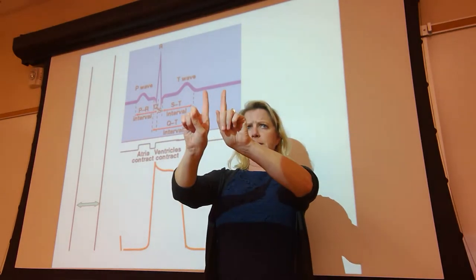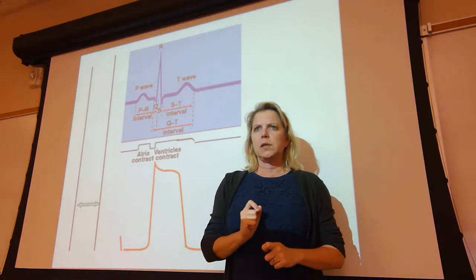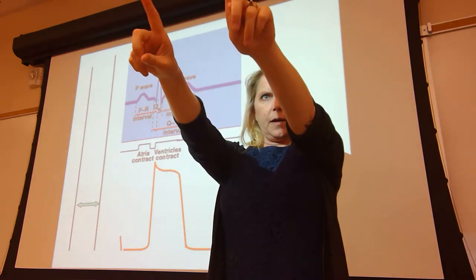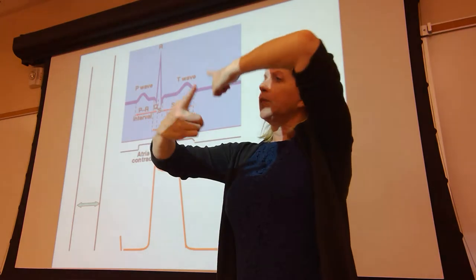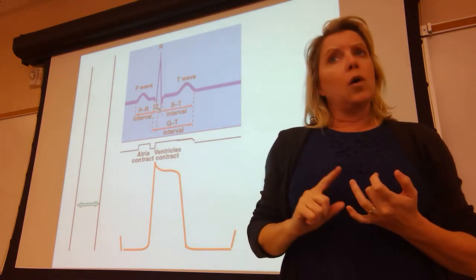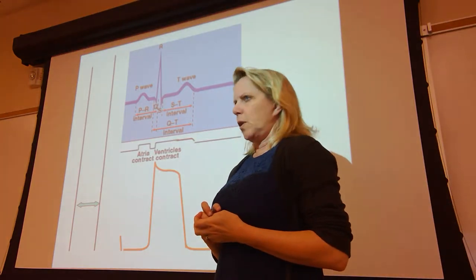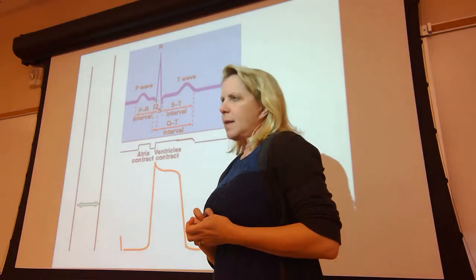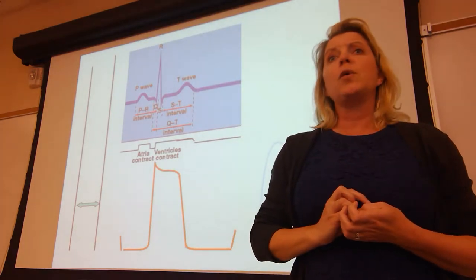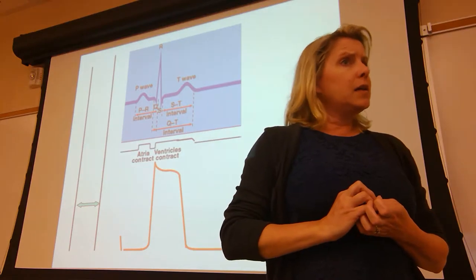This is a comparison of two vectors. And the machine with a pen obeying simple rules. Pen goes up when the cardiac vector and the recording lead are parallel. Pen goes down when those two vectors are anti-parallel. Pen will go to flatline when there is no current or perpendicular. Now, never will I ask you about perpendicular vectors. Never. But I beg my students to remember that the pen will flatline if there's no current. I also beg you to remember that it could also go back to baseline if it is perpendicular.